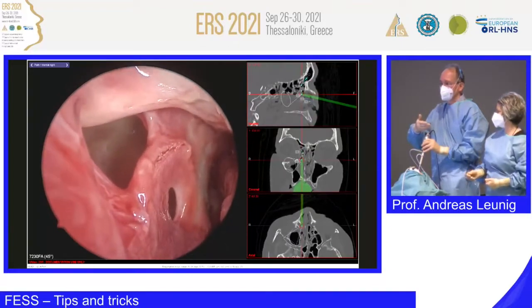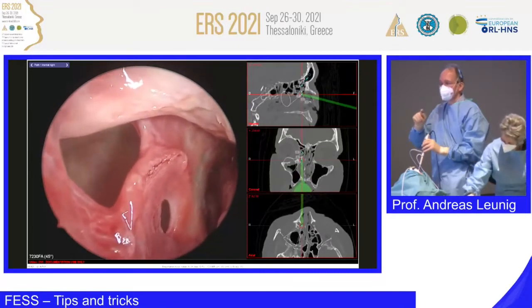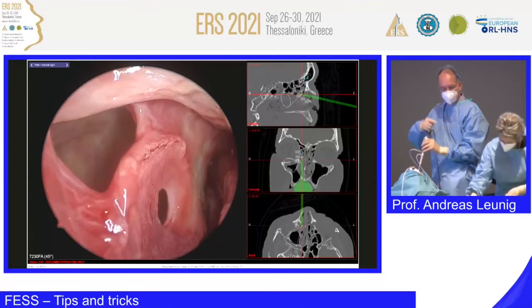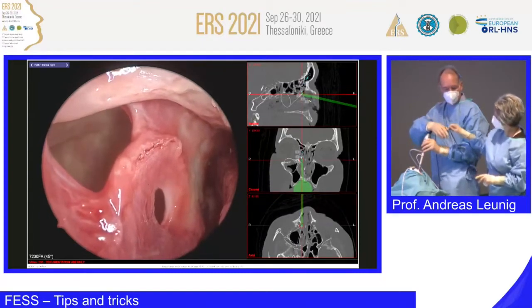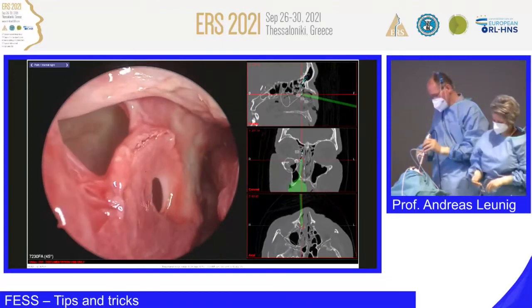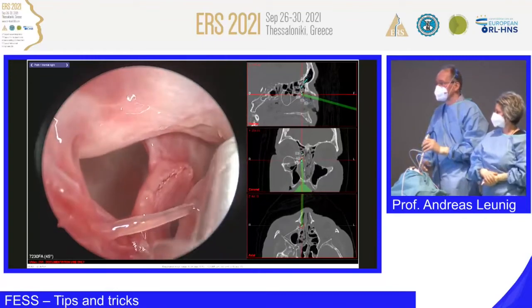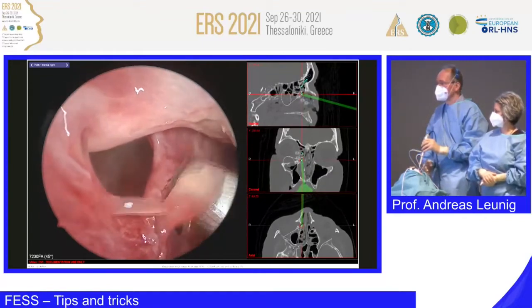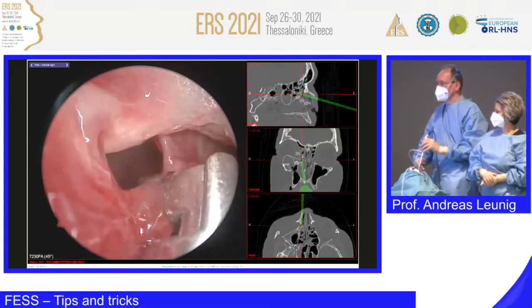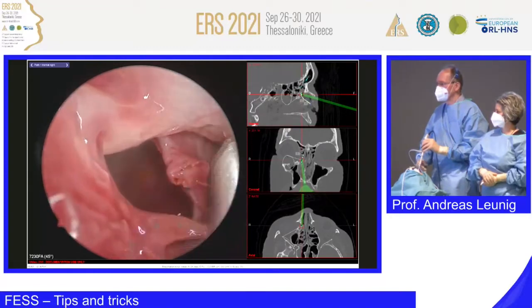Give me a side biter. Now I show you the possibilities of the surgical techniques with different instruments. Yeah, side-cutting, exactly. No, the other one. Okay, so this is a very helpful instrument in going in. Now a little bit of debris on my instrument. I'm going in and I can cut, zack, make another cut, zack.